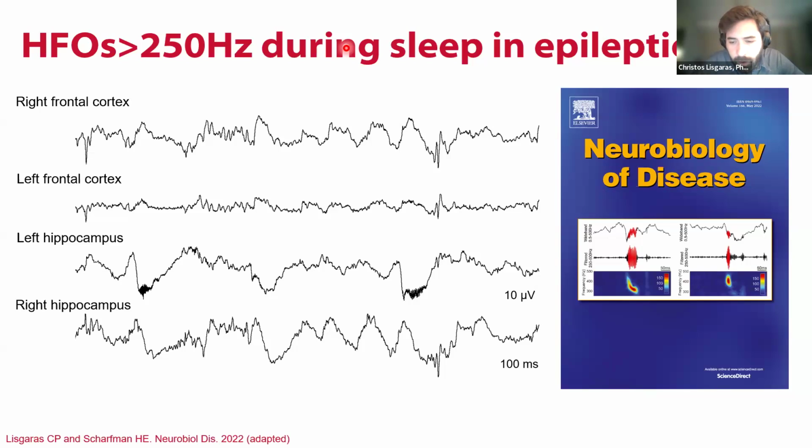We use stainless steel electrodes for depth electrodes, and the screw electrodes are, I think, also stainless steel. As for the best thickness, it was 50 microns, I think, for the depth electrode. For the silicon probes, it's also 50, if I'm not mistaken.